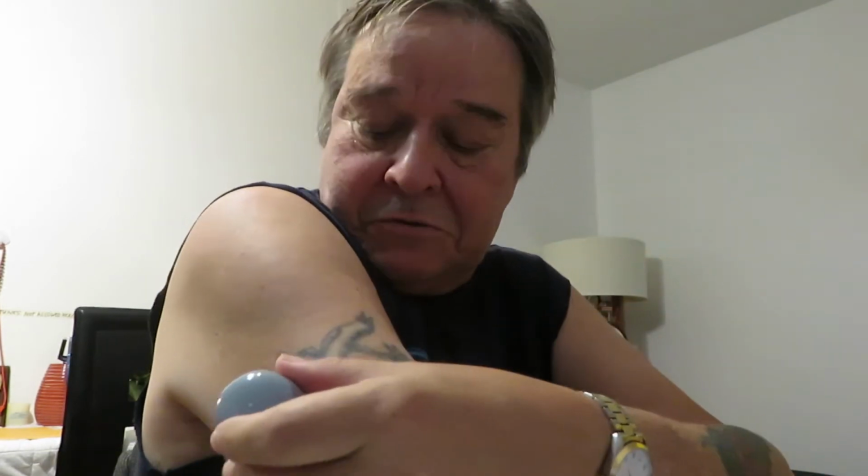Okay, now we're going to put it on. Just take it, put it on. See it? Hear it snap. Pull it up. There it is. Simple dimple. And you can take showers with it.